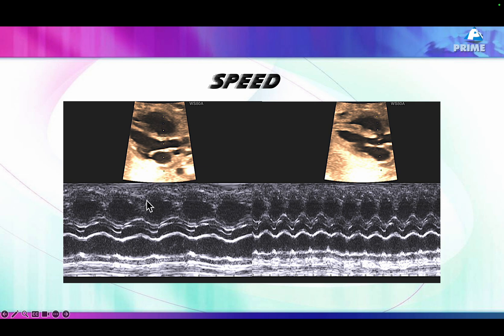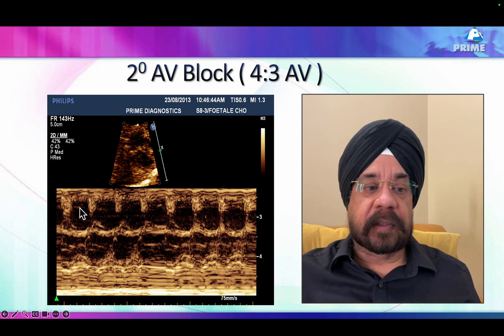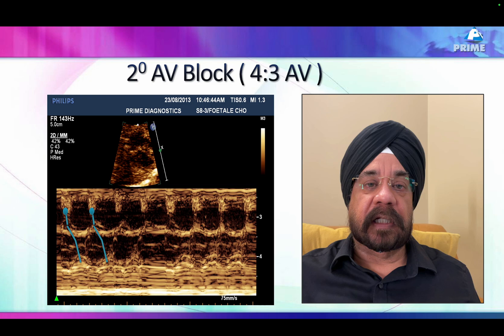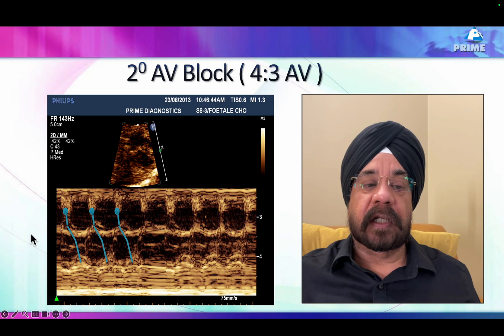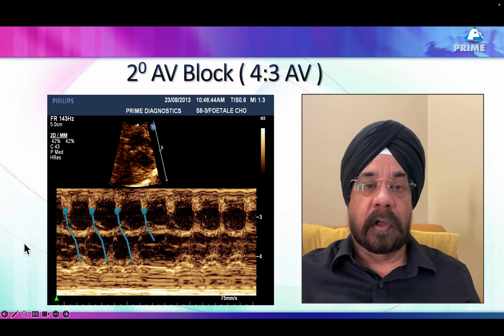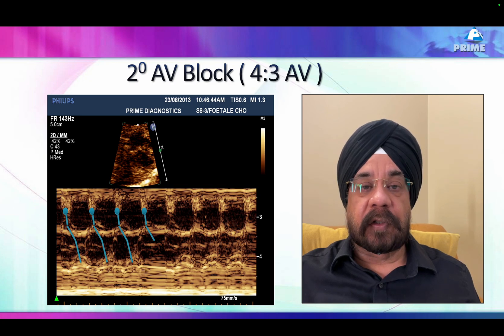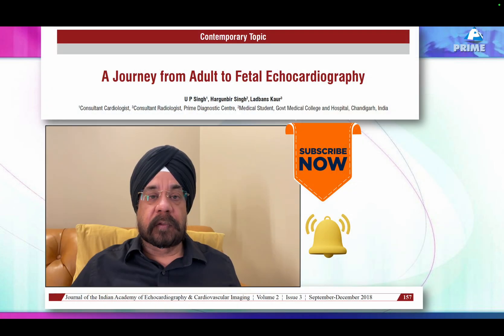On M-mode, we use atrial activity and ventricular activity. Ventricular activity is considered analogous to the QRS complex, and atrial activity is considered analogous to the P wave — that's how we analyze arrhythmia. For example, if you see atrial activity connected to the ventricle repeatedly and then an atrial activity that is not conducted down, we know this is a block. This is how arrhythmia diagnosis is made using indirect signs in fetal echo when we don't have an ECG.